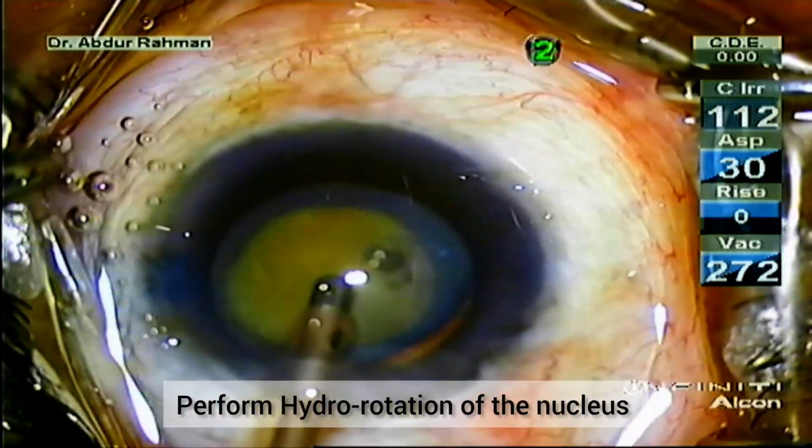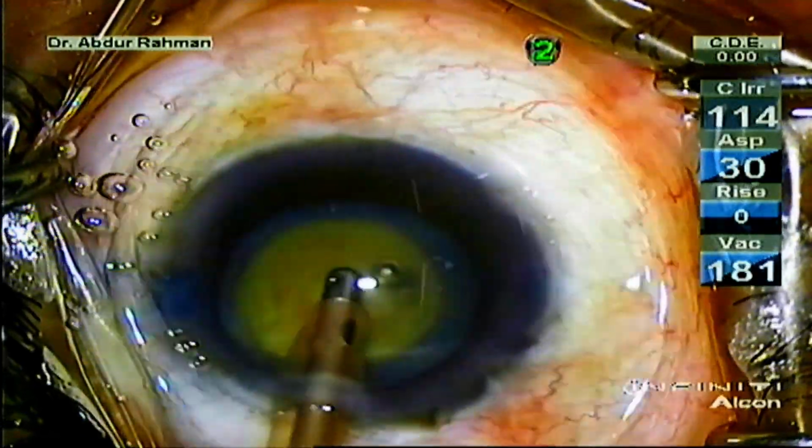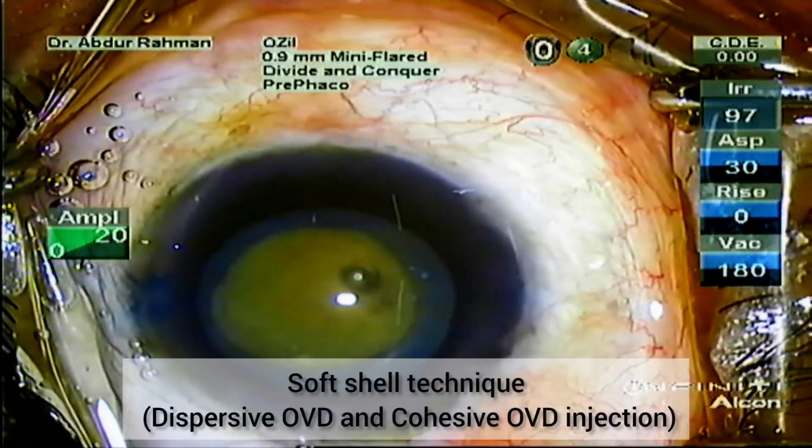From the irrigation pressure, you can see that the nucleus is spinning. I call it hydrorotation of the nucleus. How beautiful it is spinning.